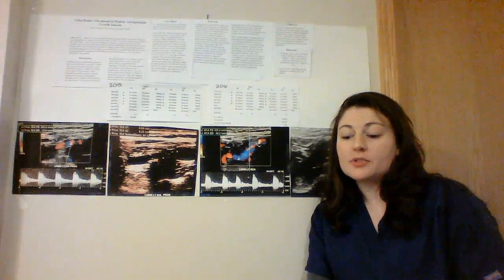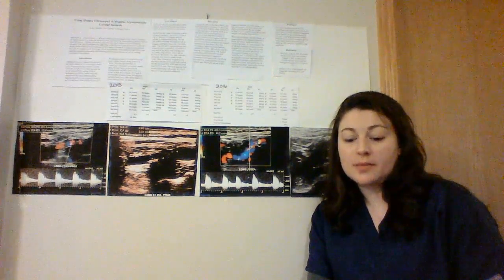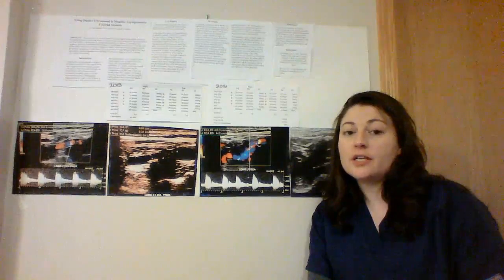This case demonstrates the need for monitoring carotid artery disease, especially in an asymptomatic patient with a known stenosis. Medical management is a way to decrease risk factors and stroke until intervention is needed. Duplex ultrasound is a good way to monitor carotid artery disease based on its non-invasiveness as well as its specificity and sensitivity.